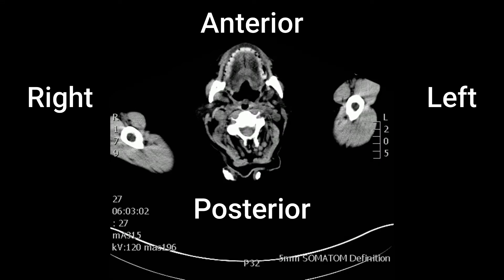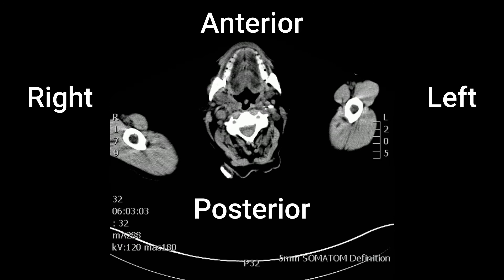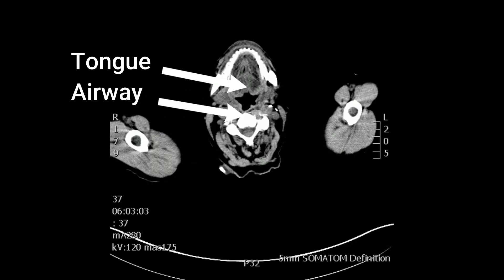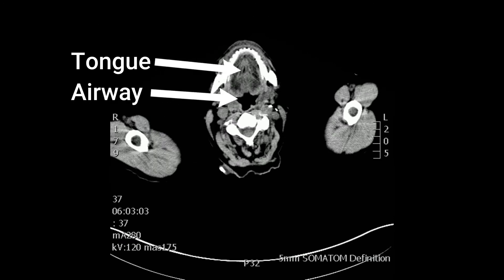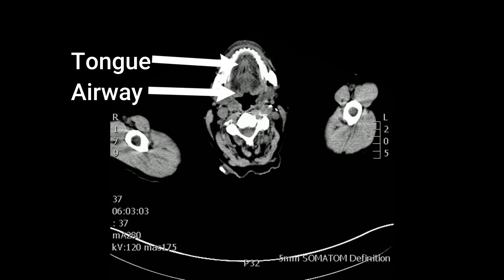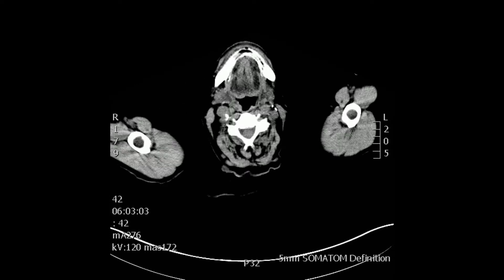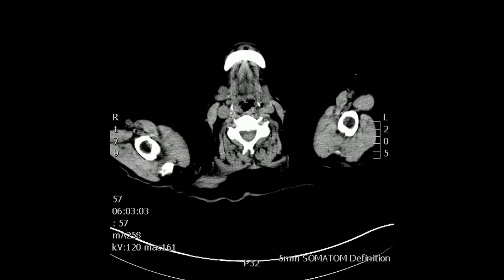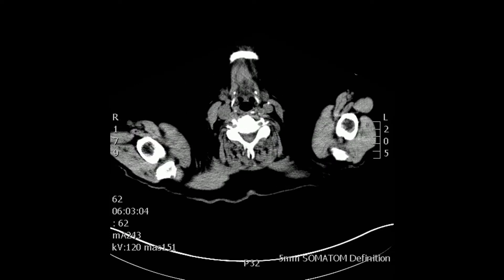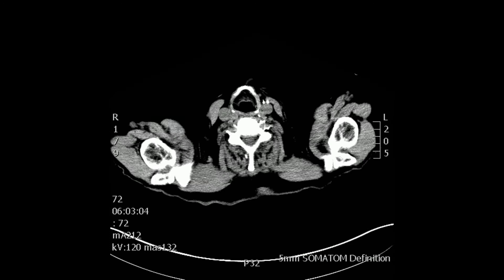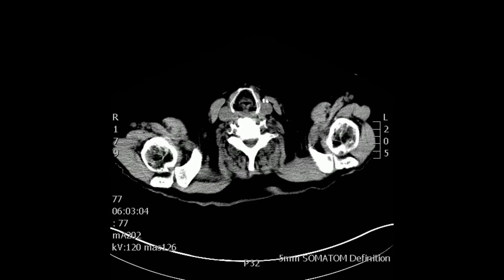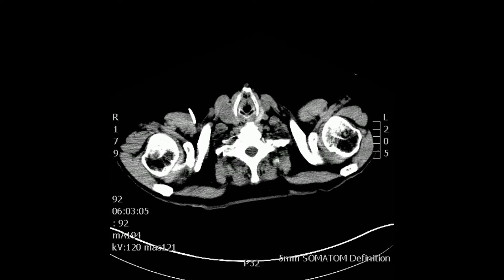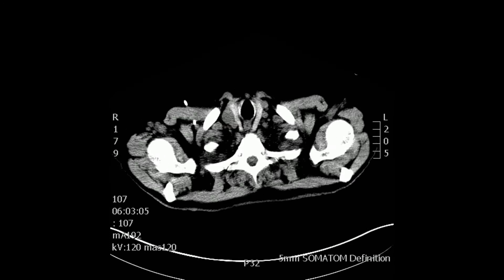See the anterior and posterior and left and right. You can see the tongue in the airway, and as we follow the airway distally, you will see the laryngeal inlet and then the glottis. This looks like the narrowest portion, and the subglottic area, and then the trachea.